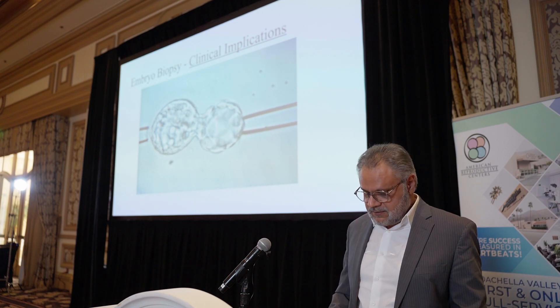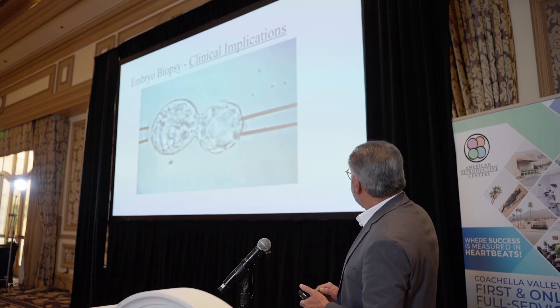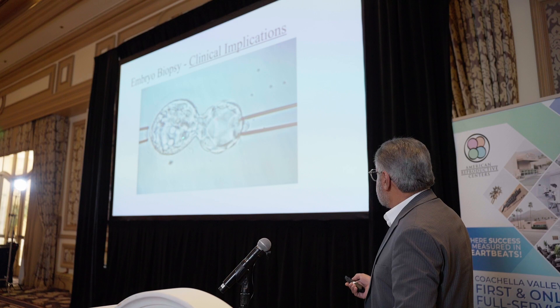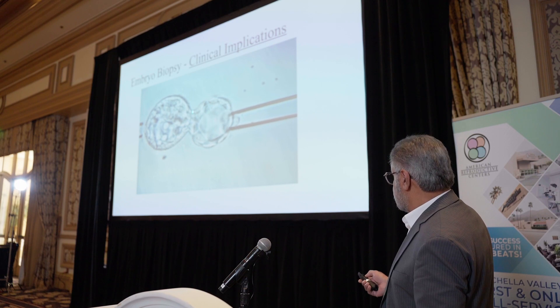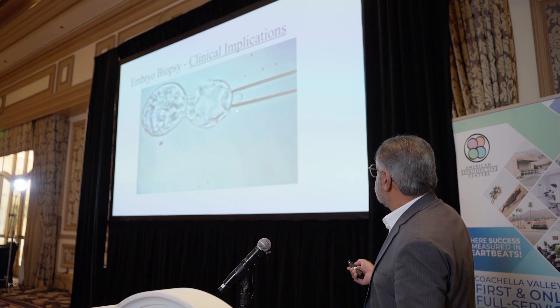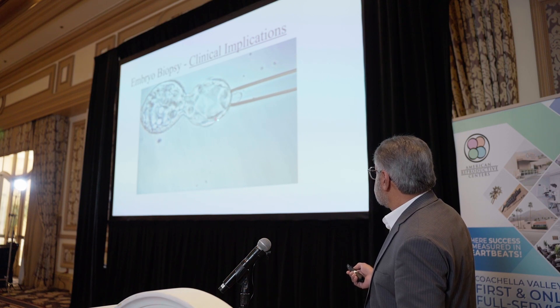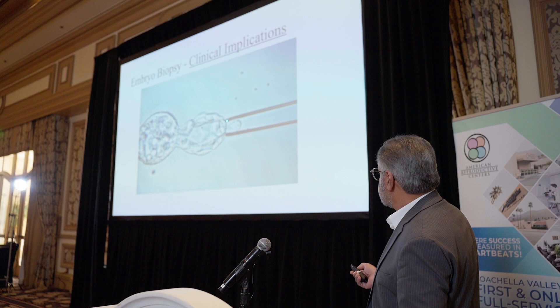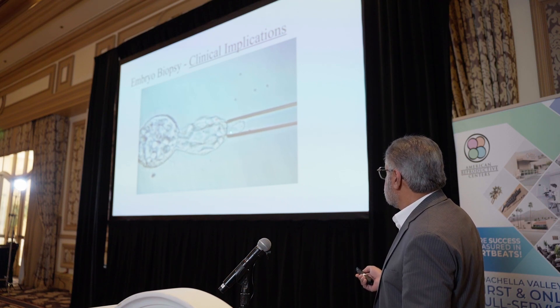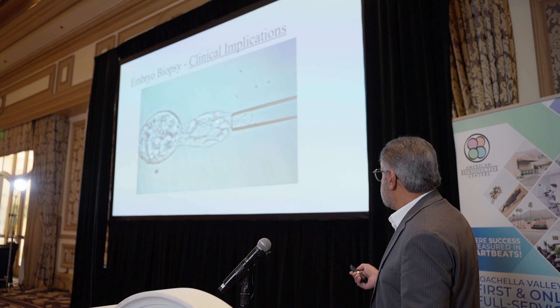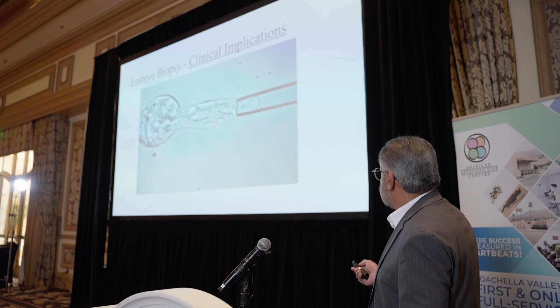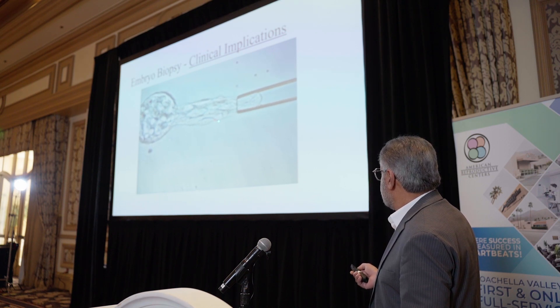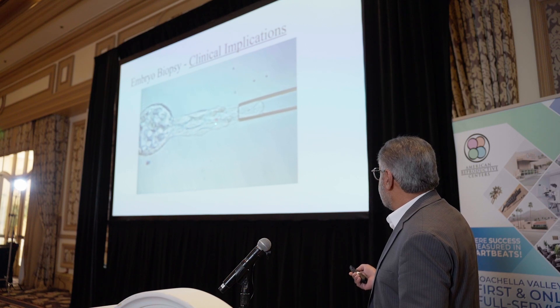This is a blastocyst-stage embryo. The ICM is here. The embryo is held under suction pressure, a gap was created here to get the trophectoderm cells out, and this is the target for the laser. Cells are aspirated out under very gentle suction pressure, and then the laser is shot in between the two cells.